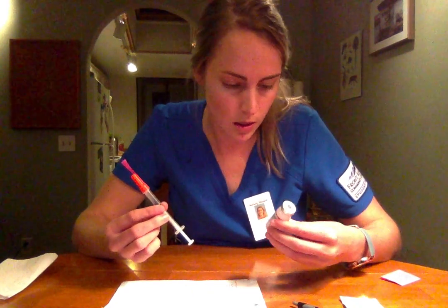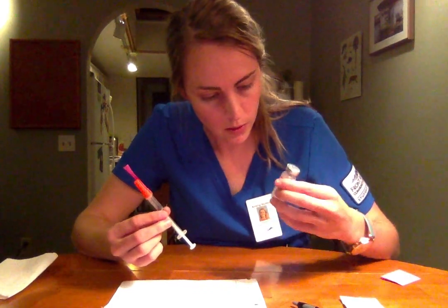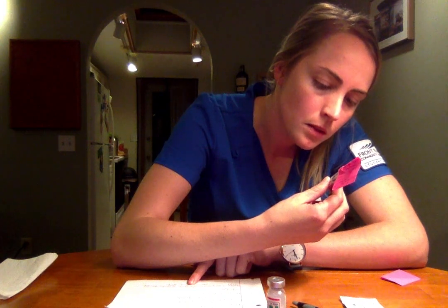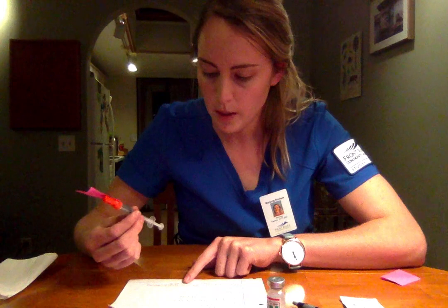The correct drug, so NPH insulin, and NPH insulin 100 units per milliliter here. And that's what I just used to draw up medication. So I have the correct amount, so 26 units, and I'm going to verify that here. Third mark down, 26 units, no bubbles. Alright, the route is subcutaneous. That's what I wrote.